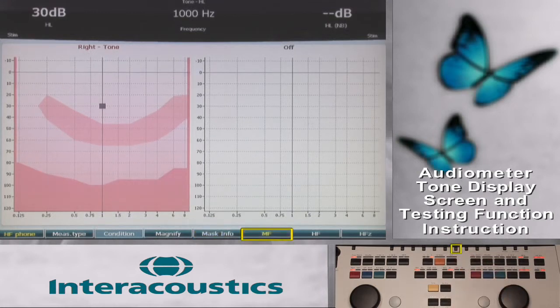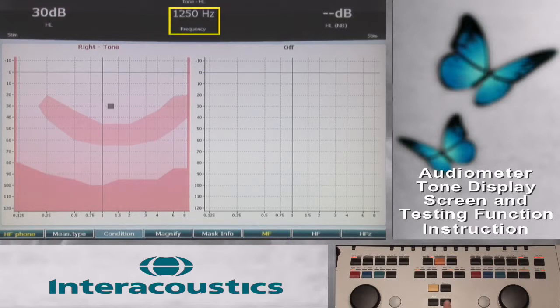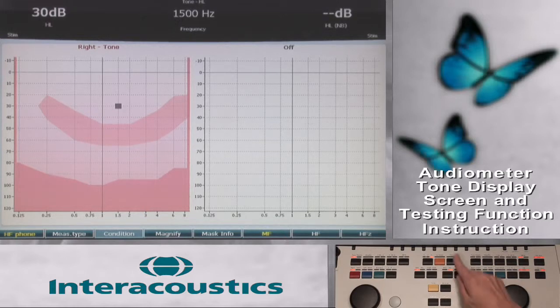The MF, or multi-frequency, function key will activate additional testing frequencies beyond the standard octaves. The quantity of test frequencies available per octave can be modified in the tone setting setup screen.